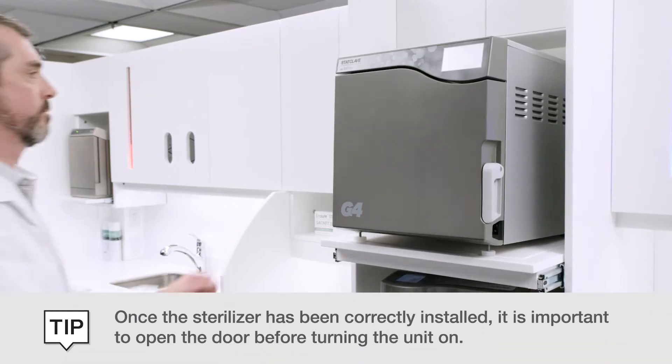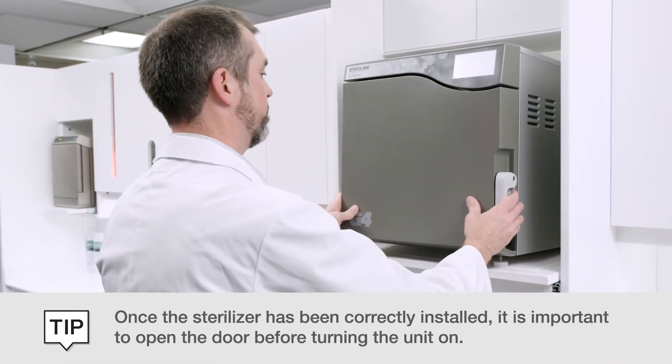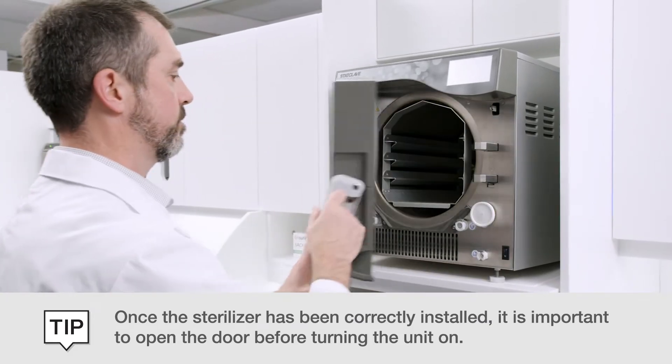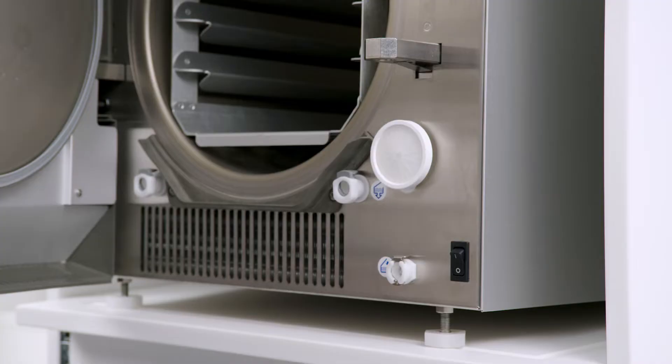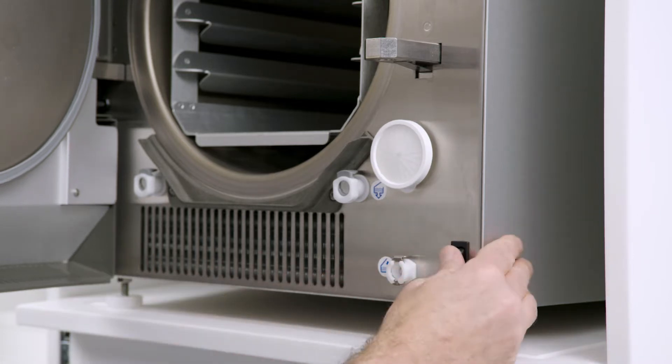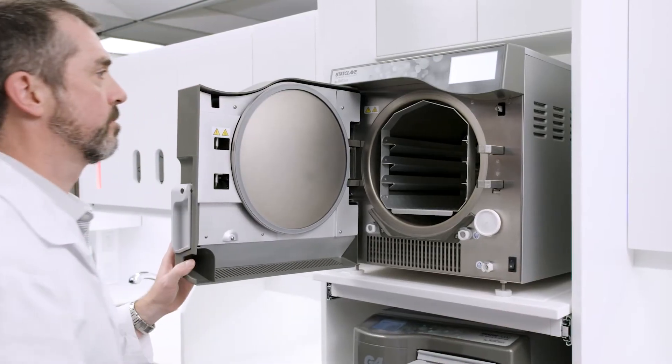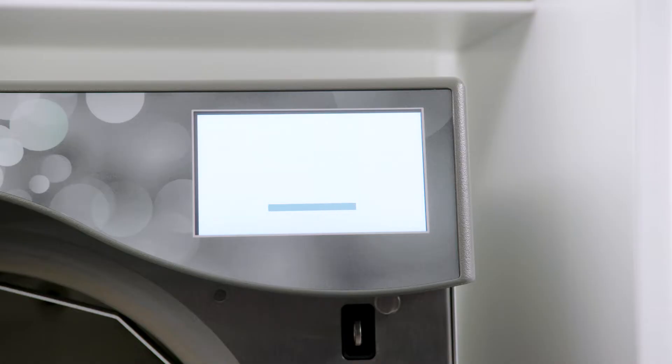Once the sterilizer has been correctly installed, it is important to open the door before turning the unit on. With the door open, the sterilizer will automatically measure the atmospheric pressure of the installation location. Turn the StatClave on using the main switch located on the right side of the unit.